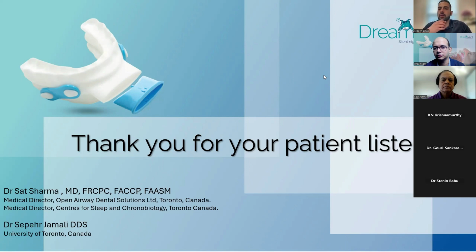And after a few nights of doing that, I almost had no patient that has a consistent issue with excessive saliva production. Almost all of them just need maximum 2 weeks, be patient with it. Some patients have hypersalivation. Some people have the opposite. So different patients react in different ways. So if you have hypersalivation, I think it settles in 1 to 2 weeks.